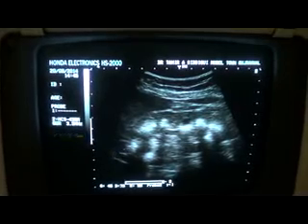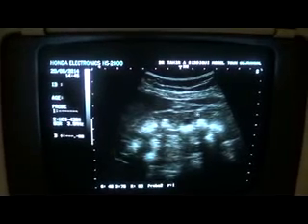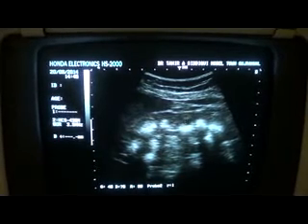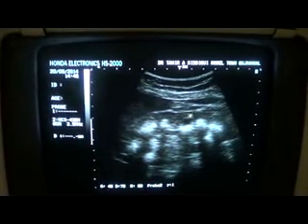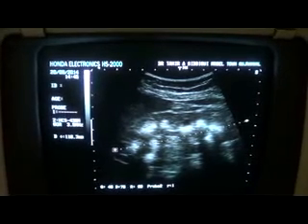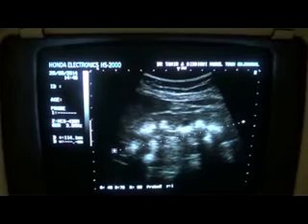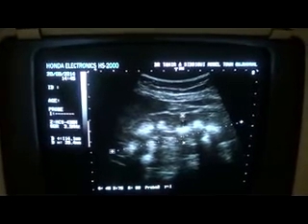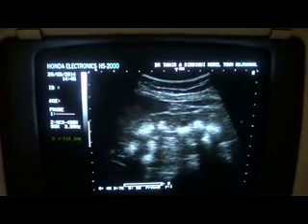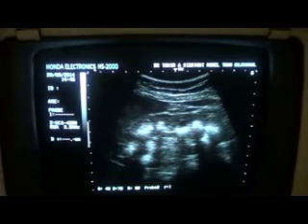So the parenchymal thickness is normal, echogenicity is normal, medulla are seen, and intact corticomedullary differentiation is seen. The kidney measures approximately 11.6 from this scanning plane and 4.0 centimeters, within normal.